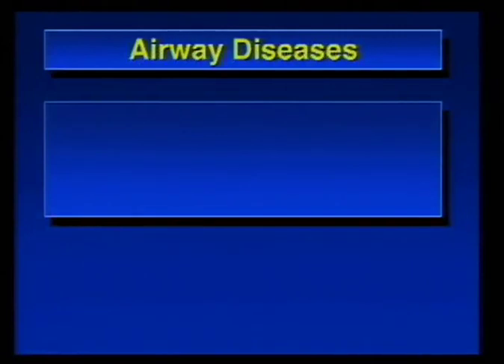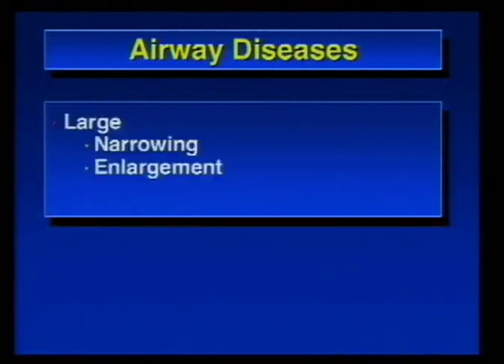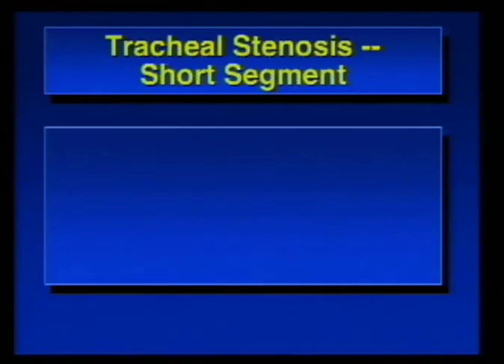Okay, so let's discuss airways diseases now. I'm going to discuss large airways diseases, both narrowing and enlargement, as well as small airways diseases. Okay, let's start with the trachea.